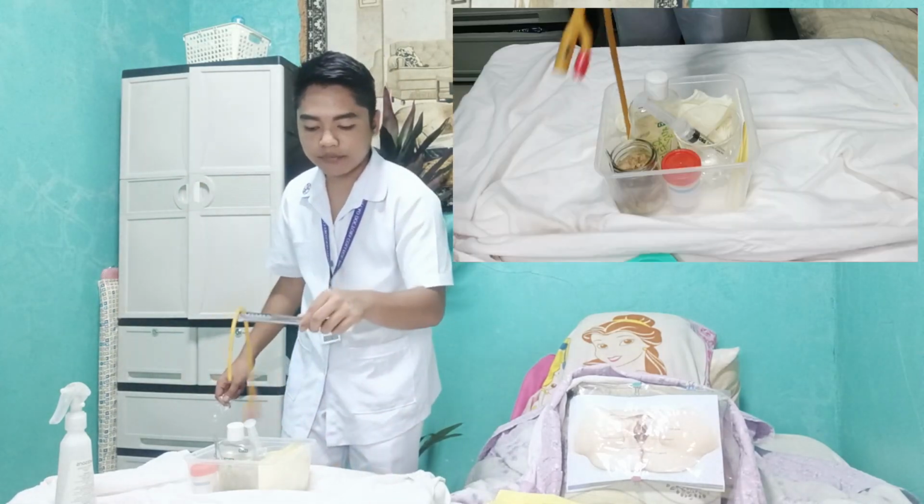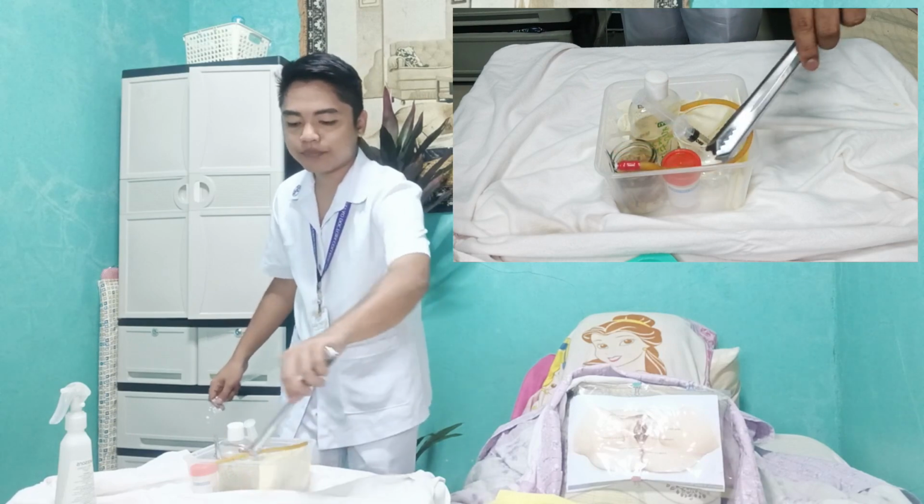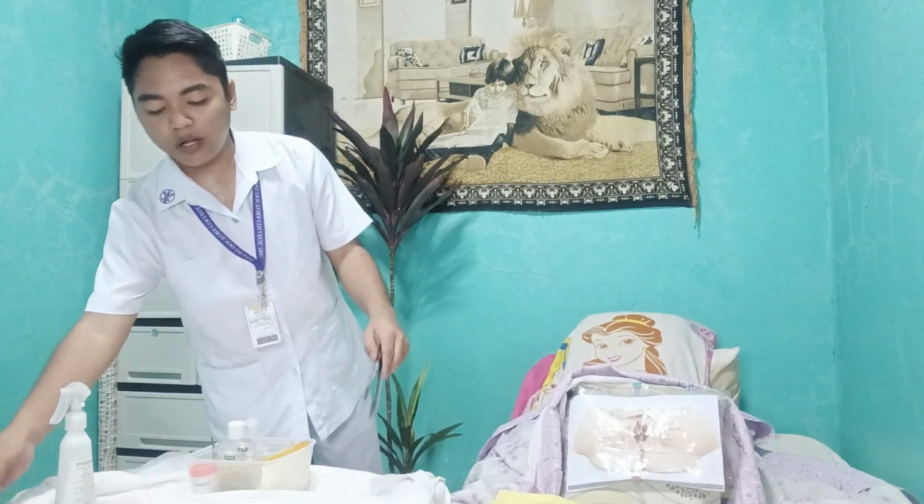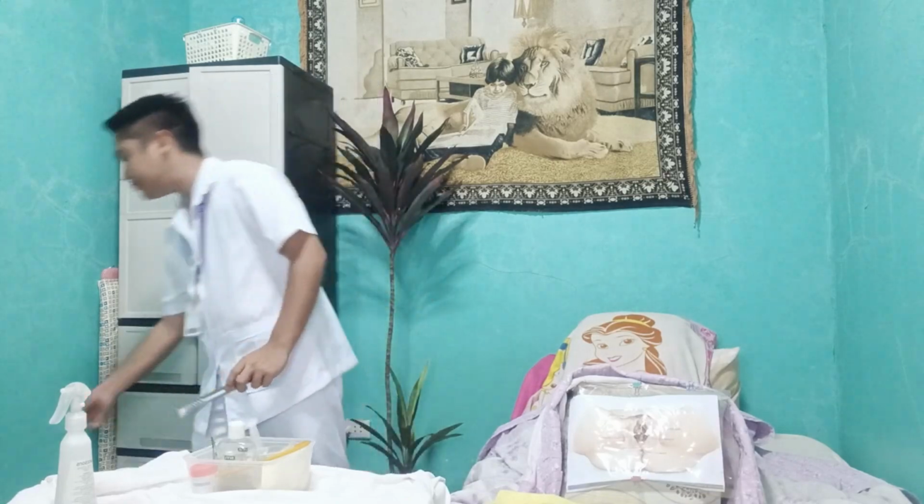I've already opened the sterile set earlier. Now I am going to add my catheter and also my urine bag into the set. Never ever touch the actual catheter and the actual urine bag to avoid contamination. It's okay if the catheter falls in here because all of this is sterile.